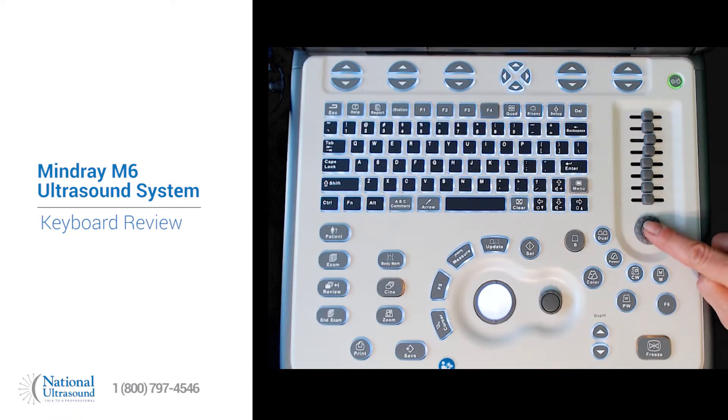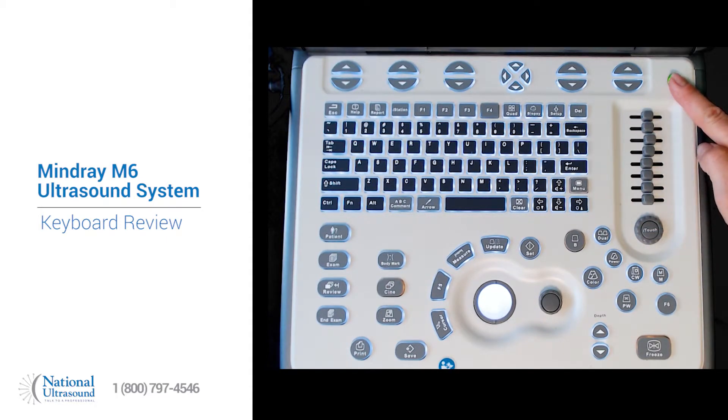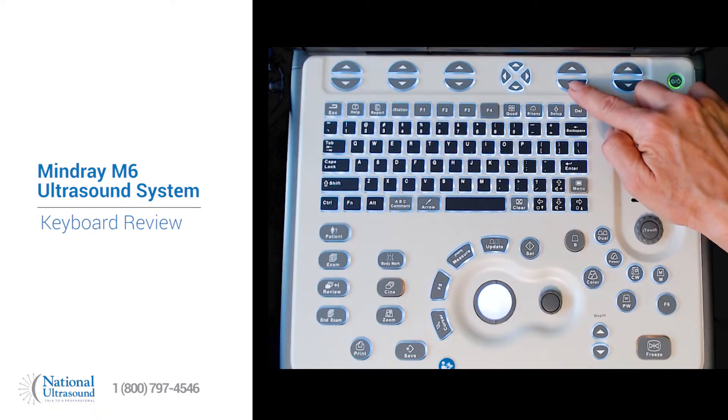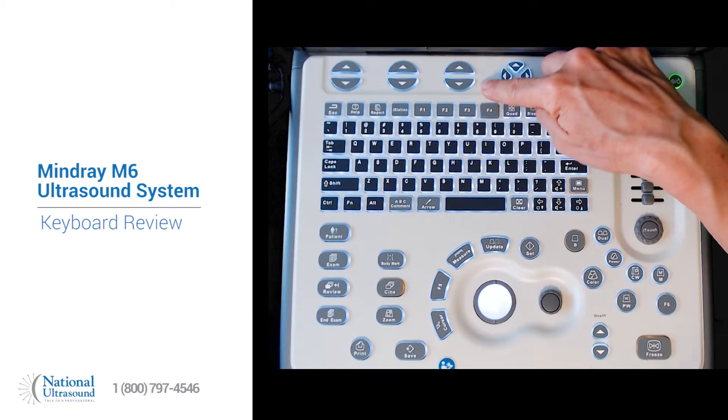The eye touch button is a one-button optimization. The exterior is an overall gain. TGCs are here, main power switch, and these buttons control soft keys that are on the bottom of the scanning screen, which we will go over in a little bit.